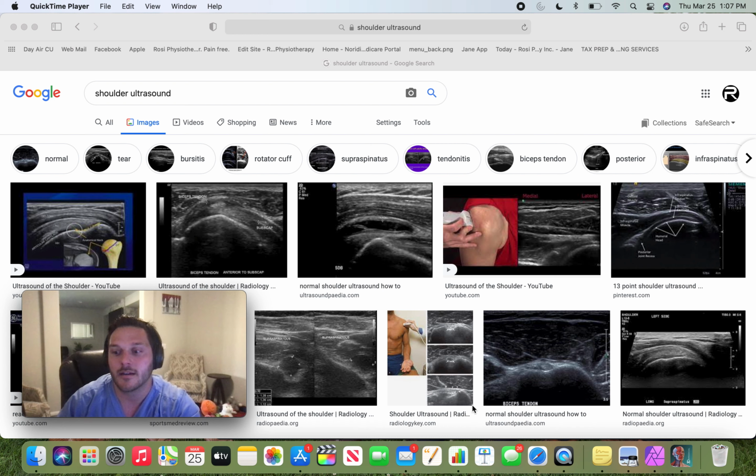Some couple things that I do in the clinic. So a patient comes in, they have non-specific anterior shoulder pain, and with that, your assessment leads you down to a couple of things. It could be long head of the bicep tendon, short head of the bicep tendon, just parascapular pain, paradeltoid pain, lateral arm pain. Either way, whatever the assessment leads you down to, that is your assessment.